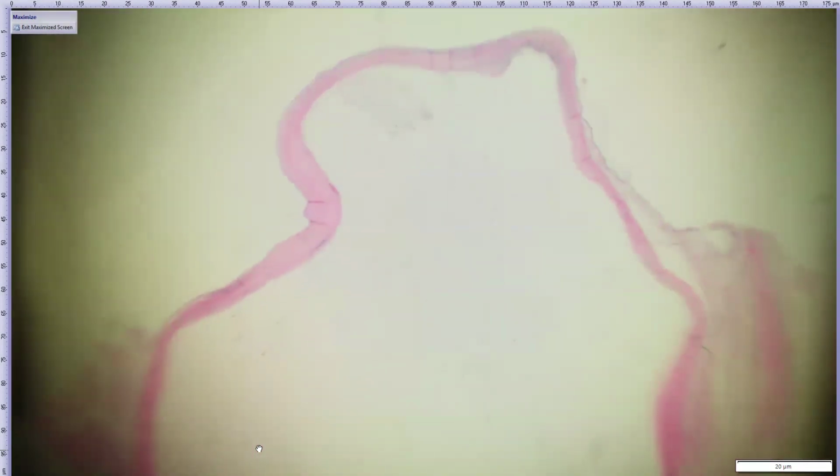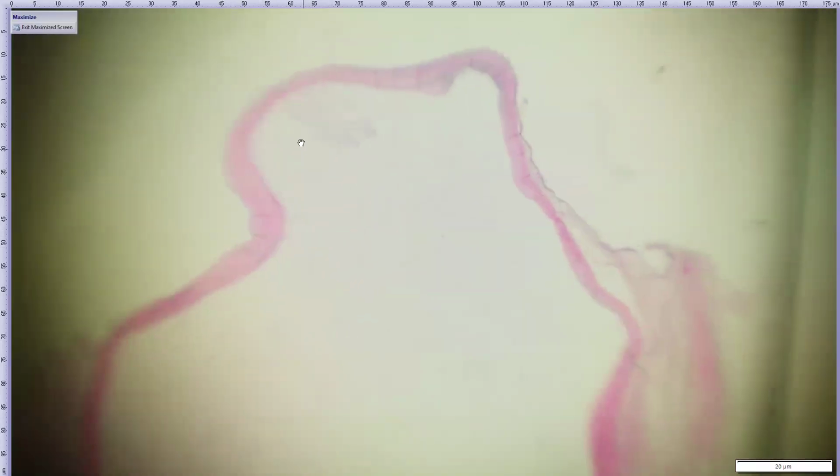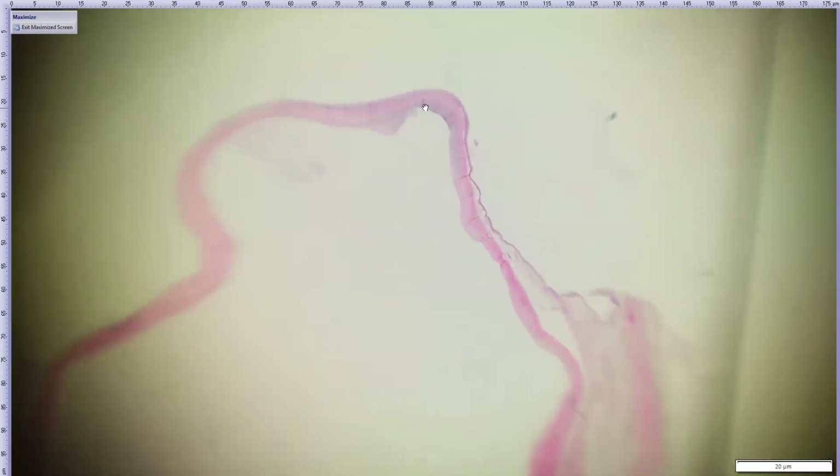So there won't be a whole lot to see subgrossly. Here is our cornea at the top. It's looking a little bit bluer here, and we'll take a look at that. Usually that means there's a little bit of hypercellularity to our tissues. And so we head back, and we can see that our scleral shell is missing our uveal tract, our lens, and our retina, consistent with their history of having the evisceration.